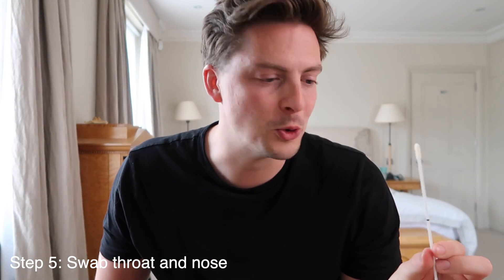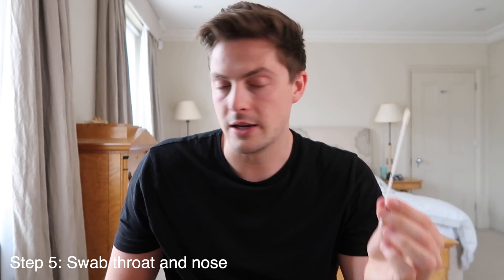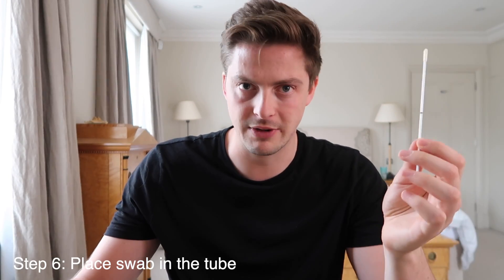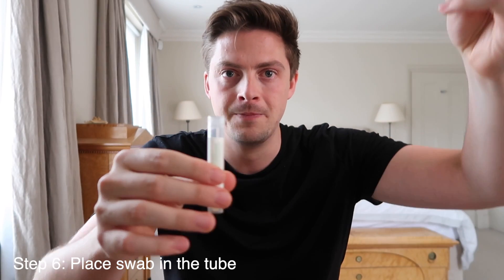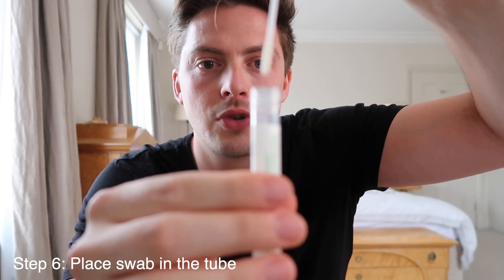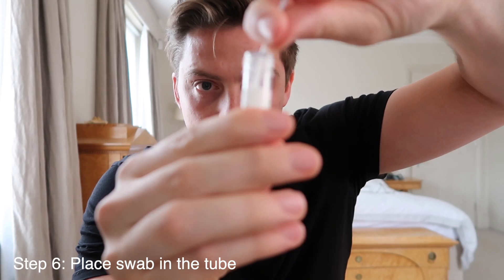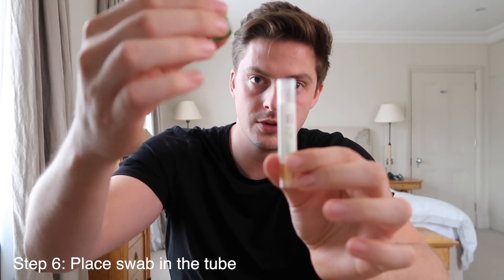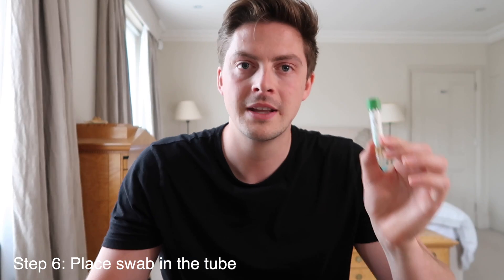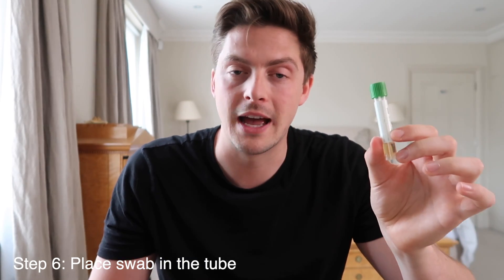My eyes watered a little, but that's normal. Ten seconds each side, and now we're going to pop this into the pot — this bit is really important to get right. Hold the pot upright so the liquid doesn't spill, then insert the swab straight down to the bottom. Then bend it where the black line is and it snaps off. Put the lid on the pot immediately. Next we need to label it up, but first wash your hands because you've been touching your nose and mouth.